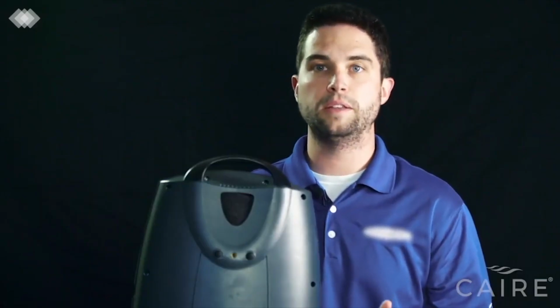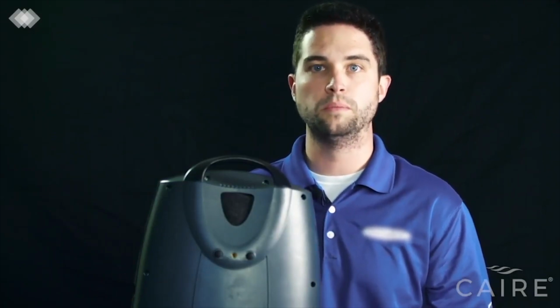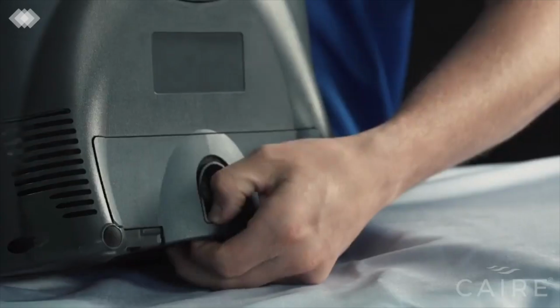Please note that your battery needs to be charged before your first use, as it's not fully charged if it's shipped to you new. To remove the battery, push down with your thumb on this black tab and pull it outwards like a drawer.